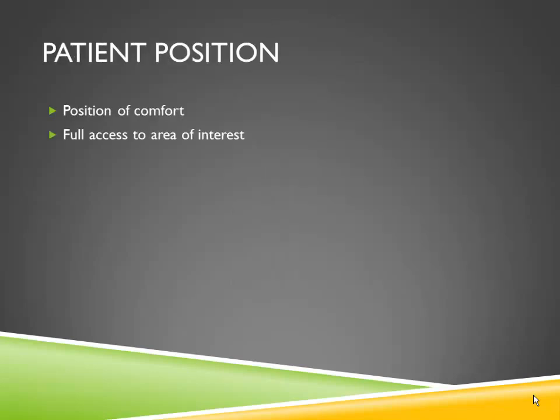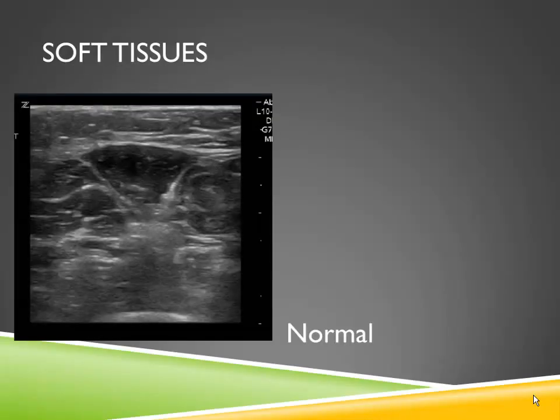And patient position is pretty easy: just wherever they're comfortable and wherever you can get the probe to the area that's infected, and that's going to be different depending on the location.